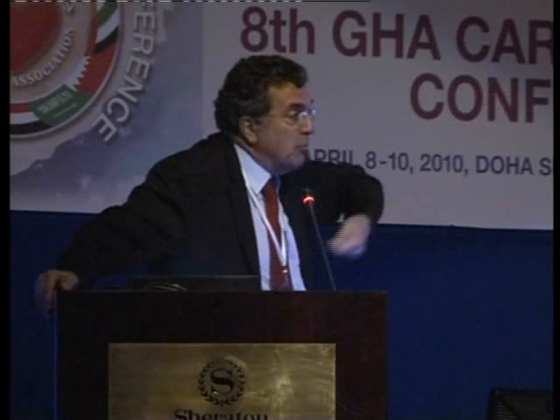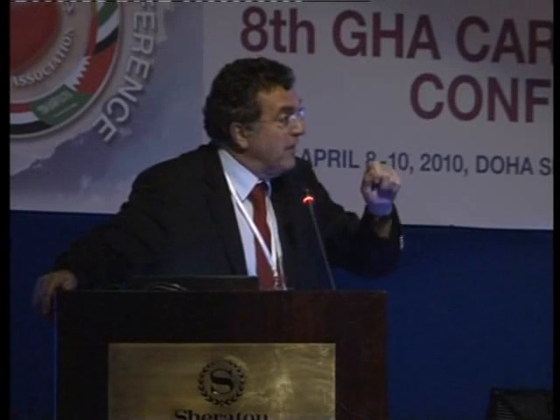Personally, I would be in favor of the first option, that is to use FFR when we have an intermediate lesion. But when the lesion is 80–90% angiographically, we do not lose time to do it, but why try to cross a critical lesion with this wire, which is not easy to advance?